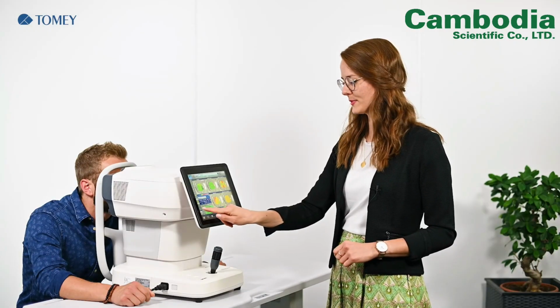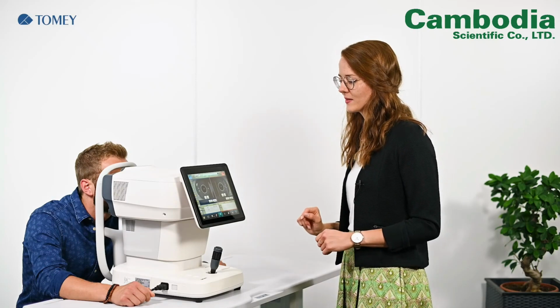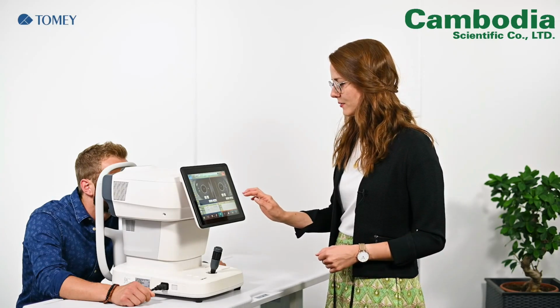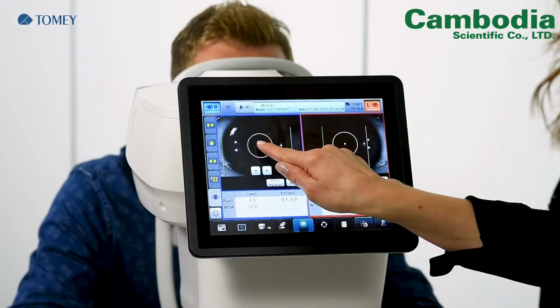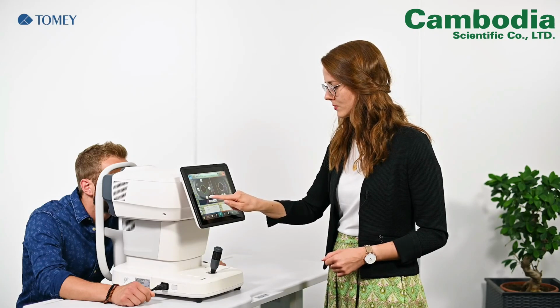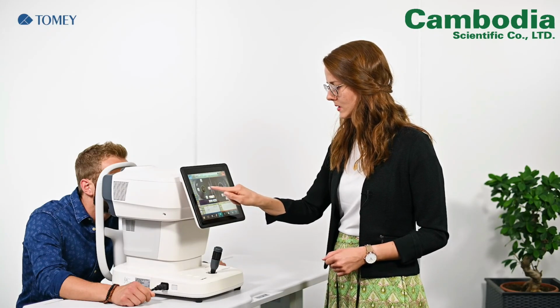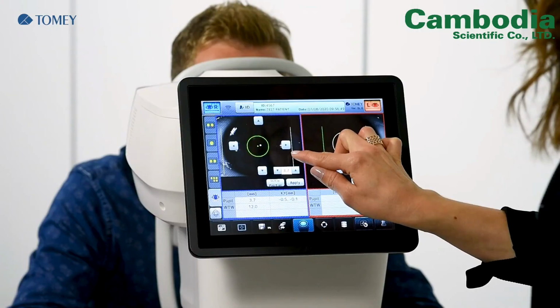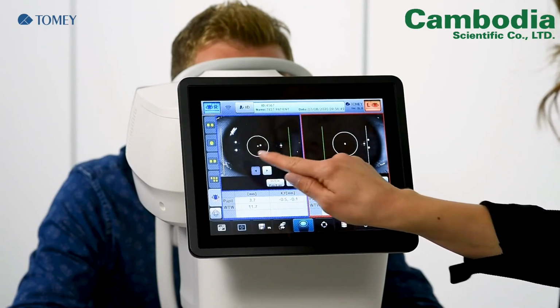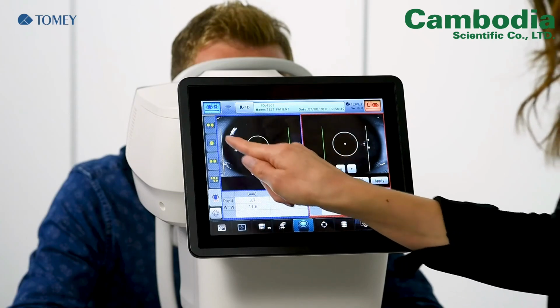You have also the possibility to measure the pupil size and the diameter of the cornea. Therefore, just type into the display and adjust the circles and bars to the size you need. So here we adjust the pupil size. Afterwards, type on the bar and put it in a little bit and onto the edge of the cornea.